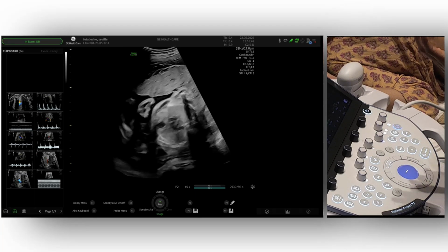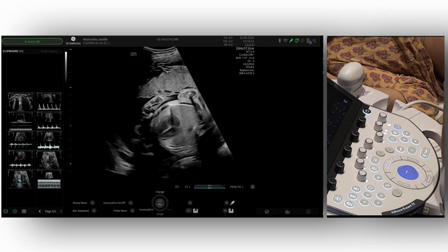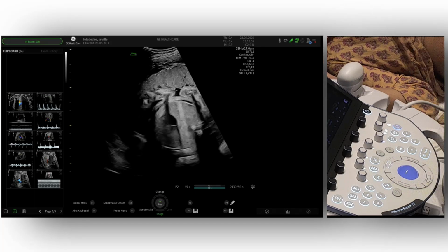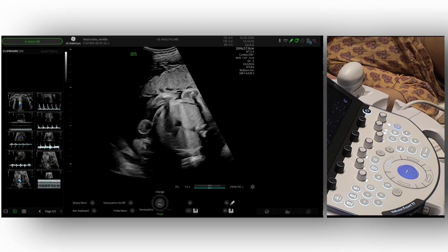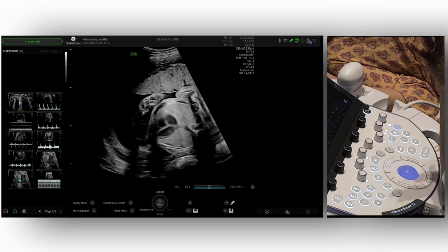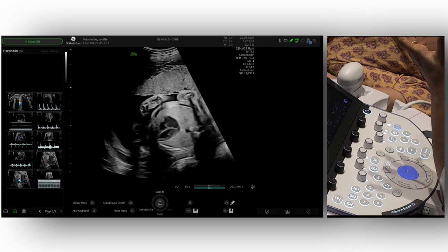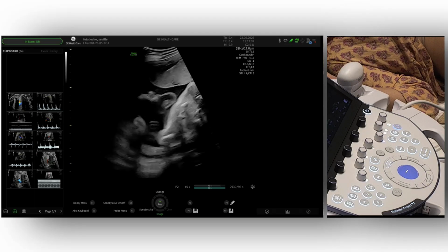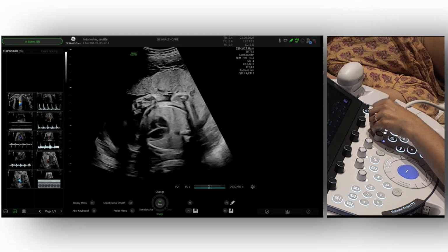You need to do one, but if you are trained to do several, it's better, because because of the position of the baby or whatever, you may not manage to get the one that you prefer, and at least you have another one. I would counsel to learn at least two of them. It's also ideal to learn it in normal babies, not in a baby with an arrhythmia, because then things get complicated, and if you never tried before, when you have an arrhythmia, you are in trouble.